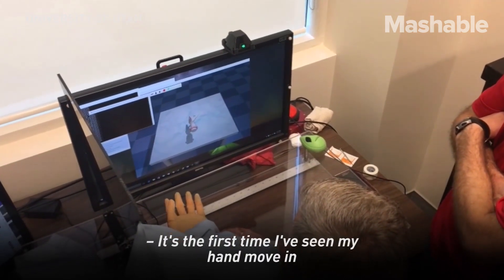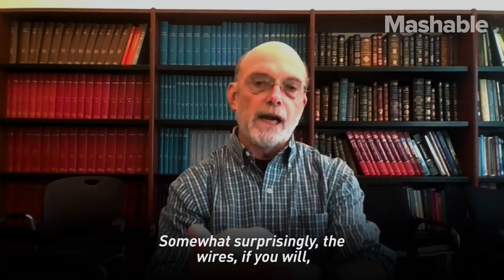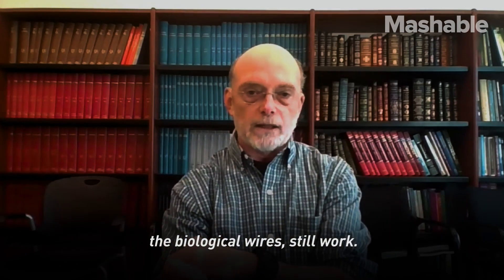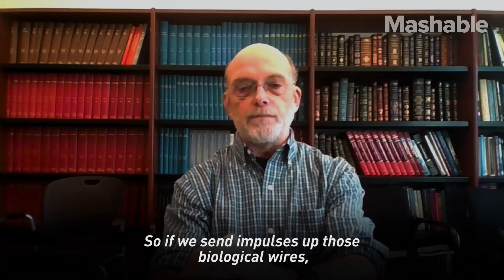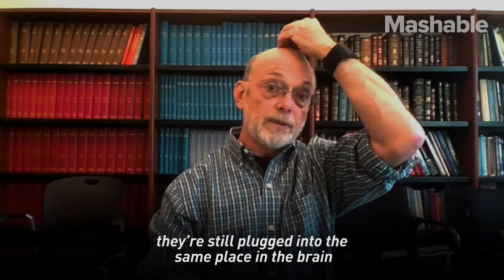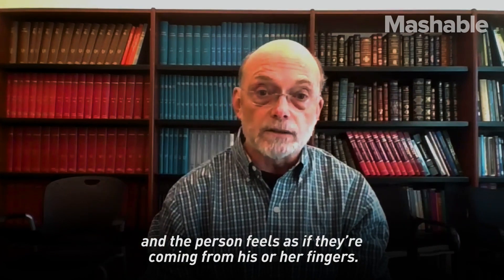It's the first time I've seen my hand move in 10 years. Somewhat surprisingly, the wires — the biological wires, if you will — still work, even though the hand has been amputated. So if we send impulses up those biological wires, they're still plugged into the same place in the brain, and the person feels as if they're coming from his or her fingers.